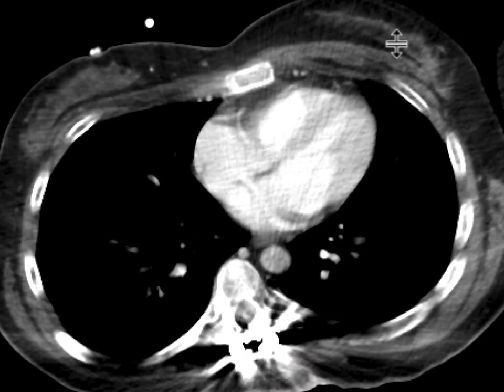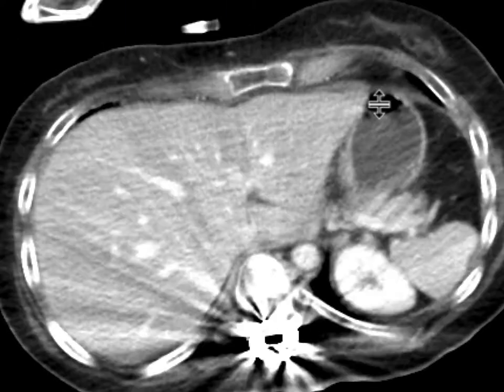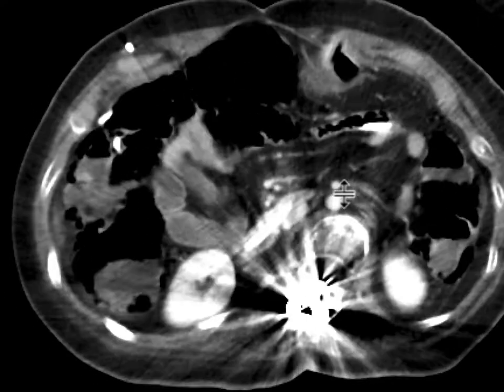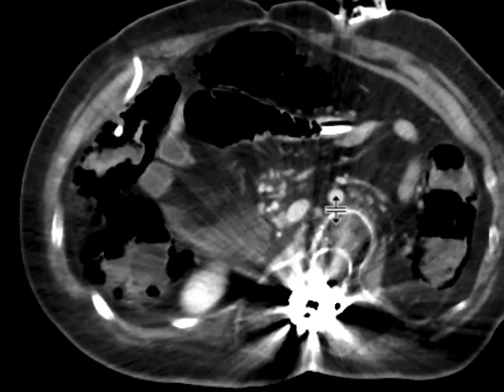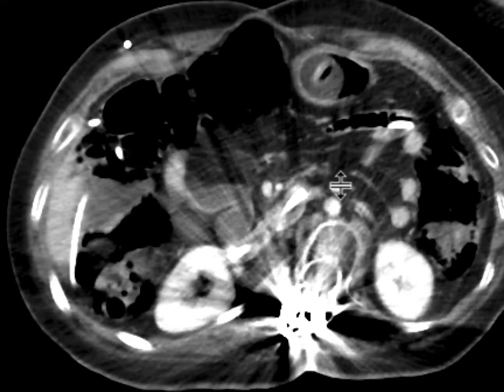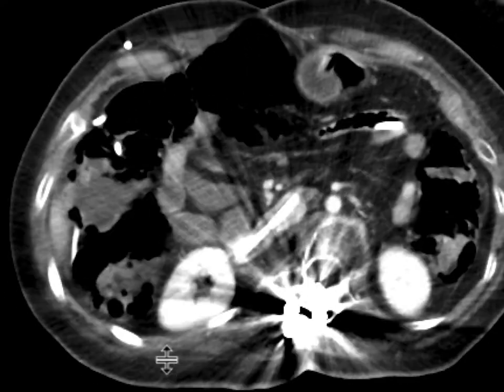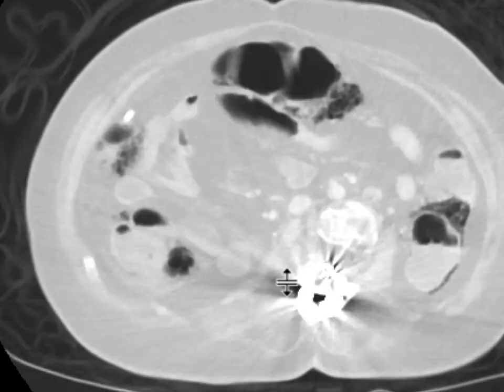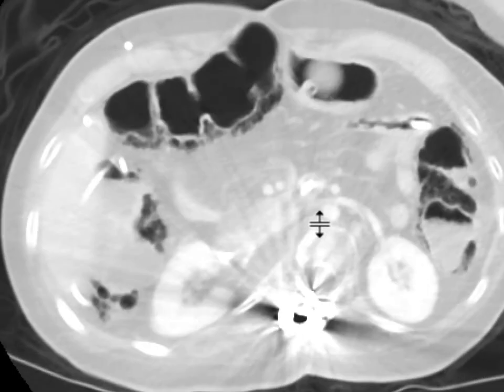Let's look at the CT scan that was done subsequently. Those findings of bowel pneumatosis are confirmed. We can see these abnormal lucencies on soft tissue windows. Let me put this on lung windows so you can see a little bit better. Abnormal lucencies within the wall of the bowel, and it's quite extensive.